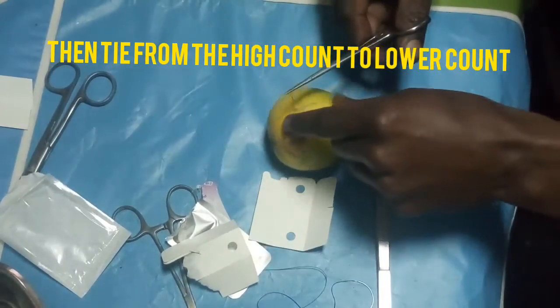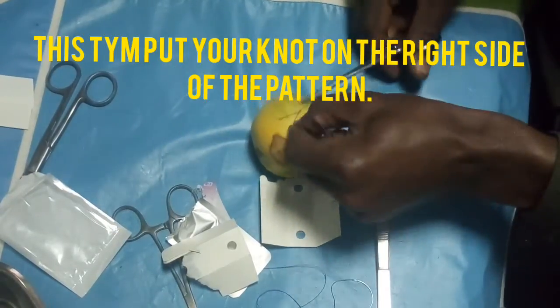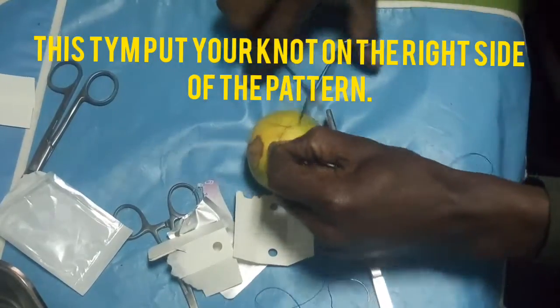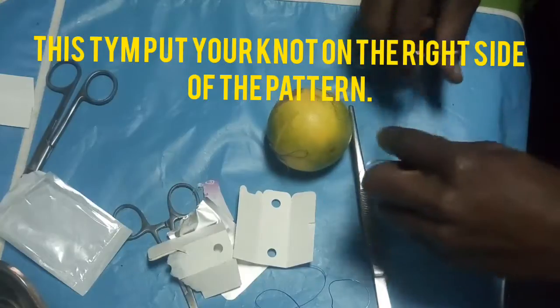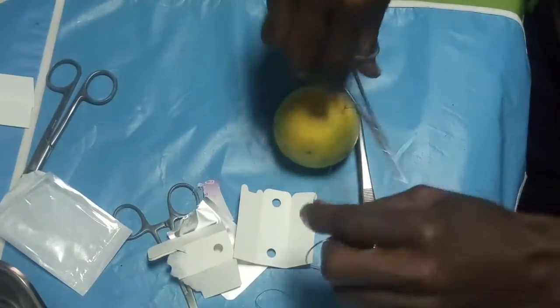This time you have to put the knot at the right side of the surgical area, so that we are able to interlock this pattern. Then you come again, you count 1, 2, you clamp, then you finish with 1.